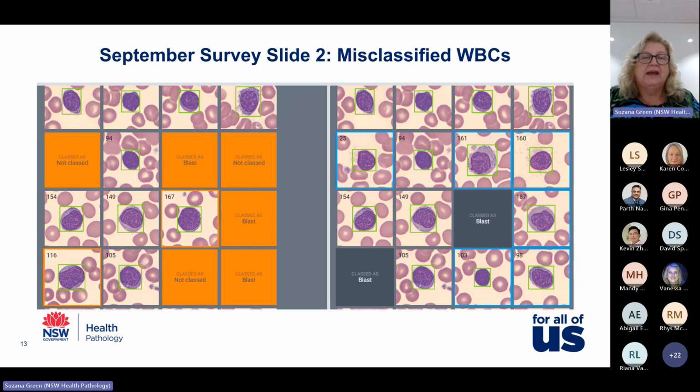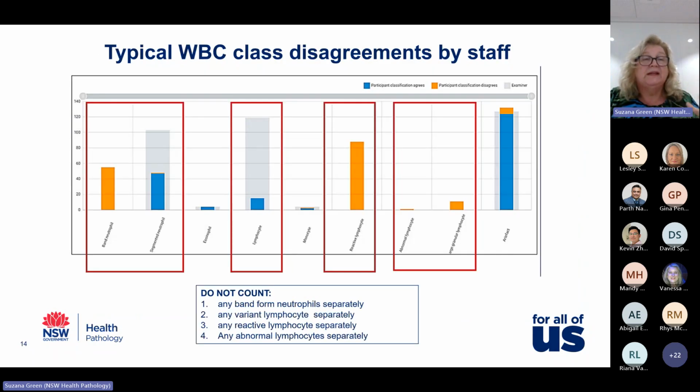So on the right-hand side, we have the examiner's results for all lymphocytes. On the left-hand side was this particular participant who then classed some of these as blasts, where we called it lymphocyte, or we called a particular one here as blast, this guy here, which would be equivalent here, and they could put it into their lymphocyte count. So you could always see how they were losing or gaining, where the agreement and disagreement was happening, either per participant or per cell class.